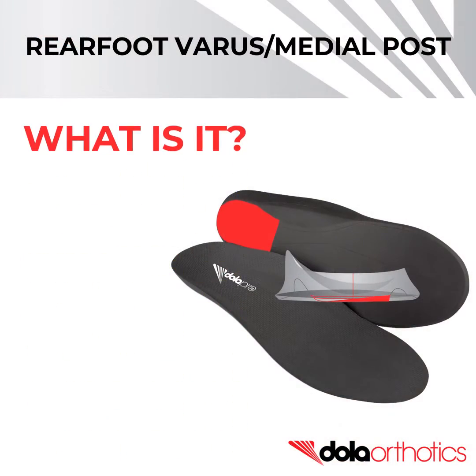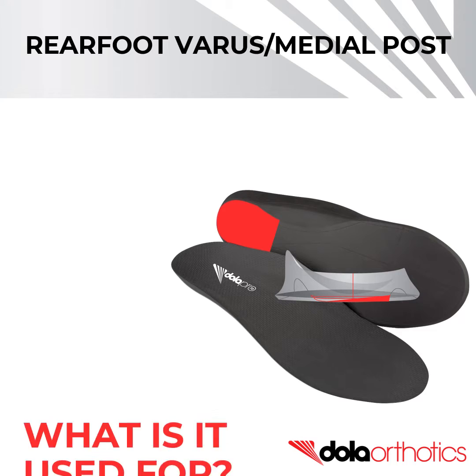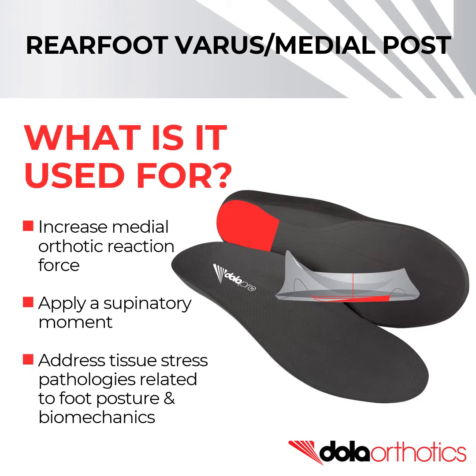A Rearfoot Varus post is a Rearfoot wedge that is thicker on the medial side. Common grinds include to the Rearfoot post clinical markings or measured to a specified angle using the heel bisection line. A Rearfoot Varus intrinsic grind is used to increase medial orthotic reaction force, apply a supinatory moment, and address tissue stress pathologies related to foot posture and biomechanics.